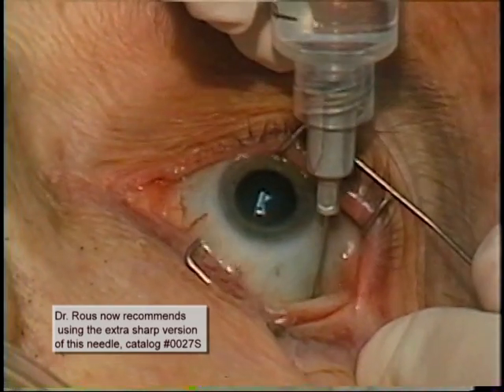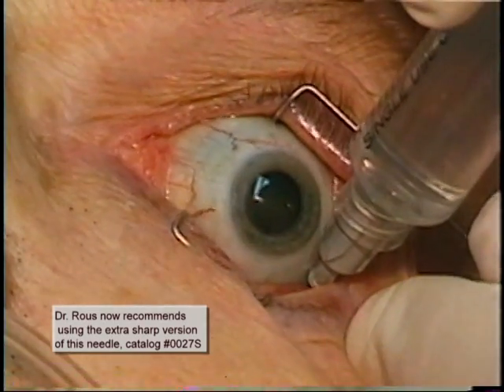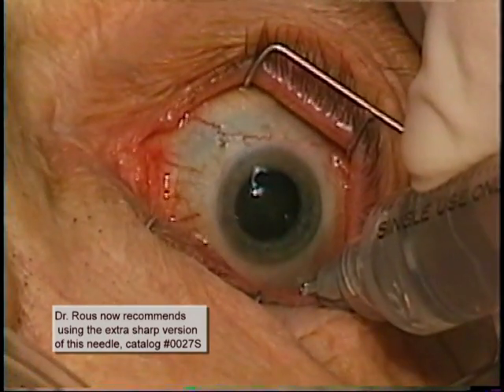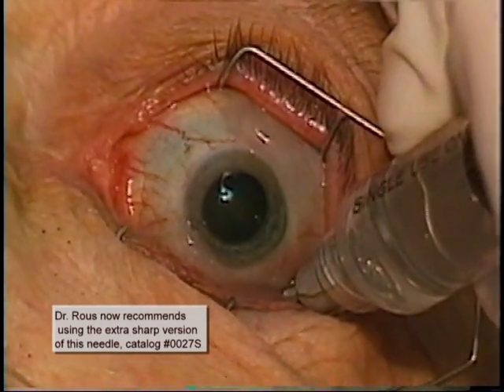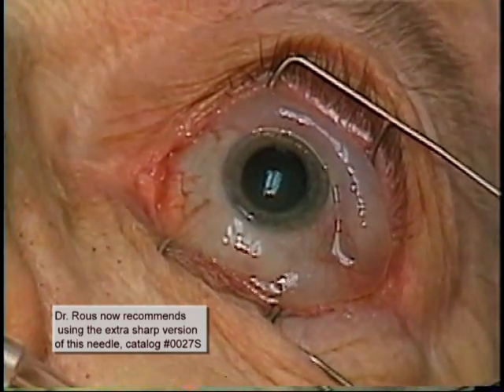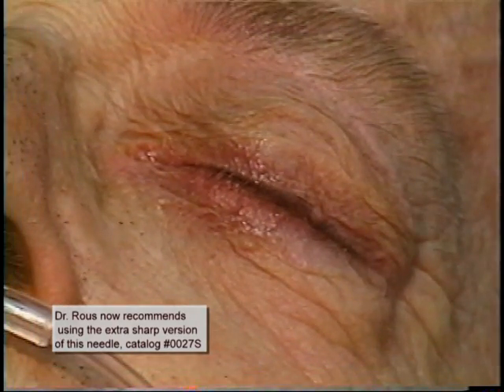This fifth case is for demonstration purposes, and shows the injection purposely of a greater-than-needed volume of anesthetic, causing a fairly significant amount of conjunctival chemosis to occur. This should not cause any concern, because with the use of the Honan's balloon and digital massage, very little residual chemosis will remain. I generally stop injecting once somewhat moderate parabulbar spread has occurred, if less than 4 cc's. Otherwise, if only a small amount of chemosis occurs, 4 cc's of the anesthetic mixture will be given.